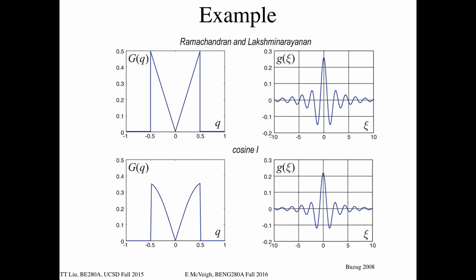So if your original data is kind of noisy, this will blow that noise up so that the picture will look very noisy. And so normally what is used is, instead of this hard cutoff at the highest frequency here, you'll roll that cutoff off so that those high frequencies are suppressed somewhat. It is key to make sure it still goes back to 0 here.